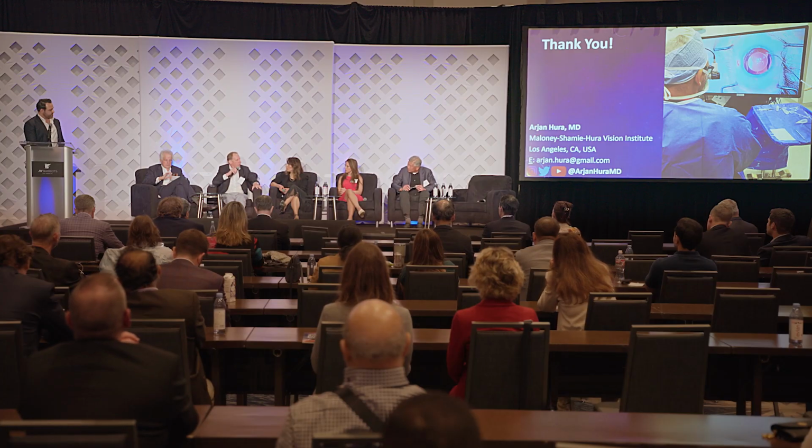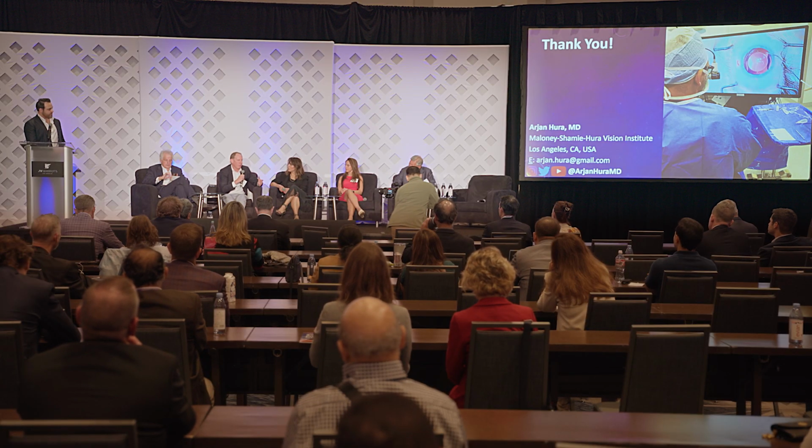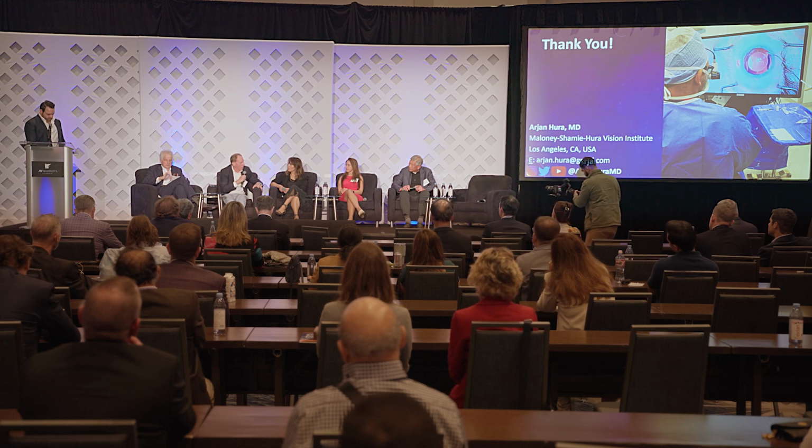The biggest lesson I've learned with RK patients is that if they come in wearing glasses and they've been wearing glasses for the last 10 or 20 years successfully, it's a great opportunity to use the LAL, because the LAL can mimic glasses with a standard refraction, right? If they have a history of wearing RGPs for most of their life, maybe had to stop wearing them recently because of the cataracts, but they're used to them, then go with a monofocal lens and have them go back to RGPs, because the LAL will be pale in comparison to the quality of the RGP vision. So I kind of learned that the hard way. Monofocal or small aperture, I think, in those patients.